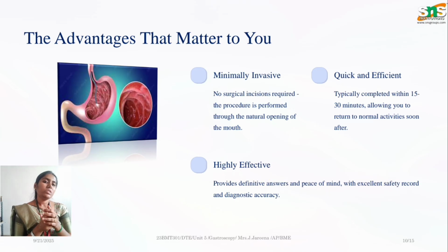So the advantages: unlike other traditional procedures, it is minimally invasive, and it is quick and efficient. That is very important as far as medical concerns go. The more quickly you diagnose the problem correctly, the sooner you can go with quick and efficient treatment.